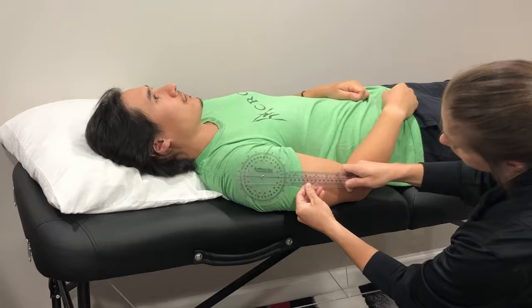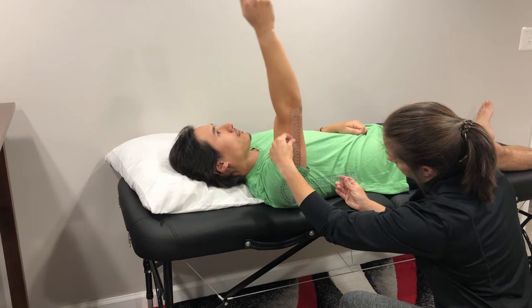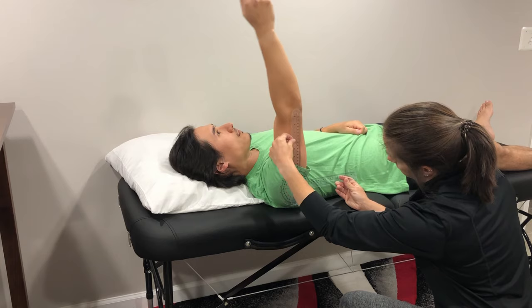Go ahead and raise your arm overhead and as far as you can towards the table. And that is measuring flexion of the shoulder joint.